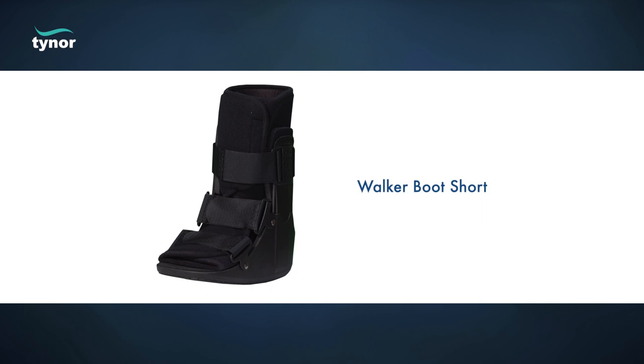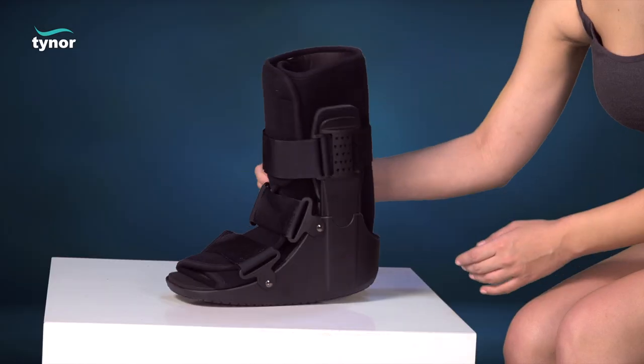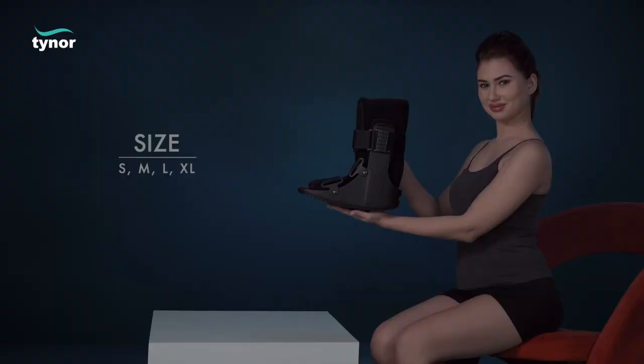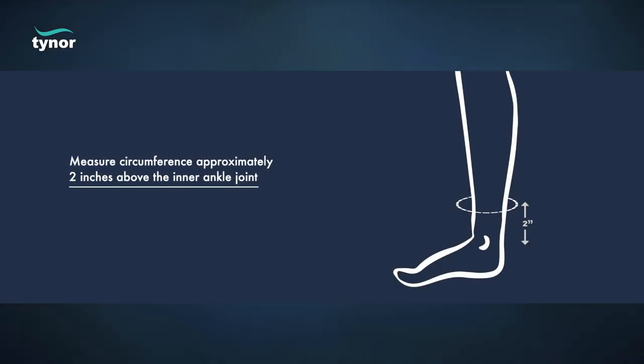Here we will discuss how to measure the size and how to wear the walker boot short. The walker boot short is available in these sizes. Measure circumference approximately two inches above the inner ankle joint.